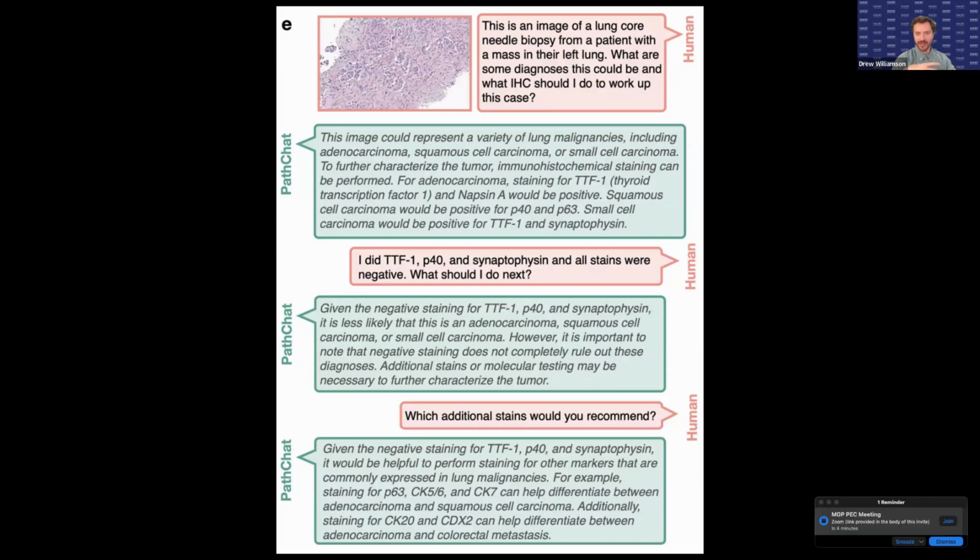And so I think one of the ways this could be used is not have its results go into the medical record at all, but sort of prepare a first draft of the report for a pathologist to work on and edit. Or maybe, if we get high quality enough training data for rare tumors that pathologists in underserved areas don't commonly see, maybe a tool like this could help recommend some IHC or other details to look for to help them diagnose that case.